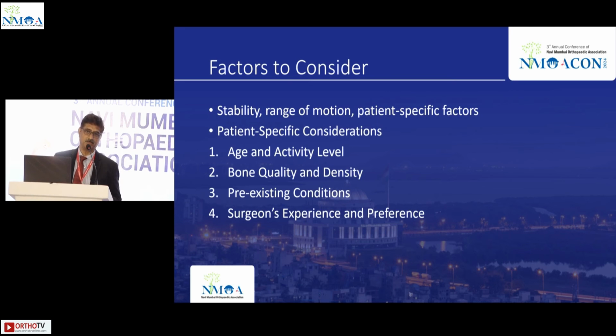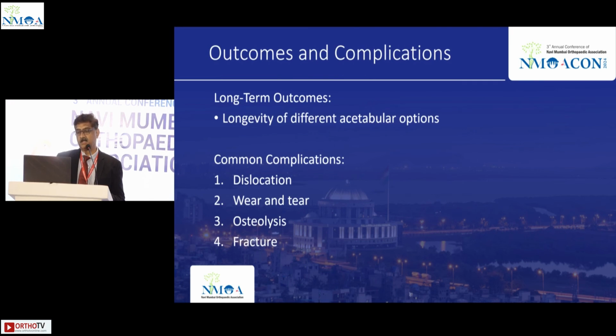Factors to consider while selecting the cup: stability, range of motion, and patient-specific factors. Patient-specific considerations include age and activity level, bone quality and density, and pre-existing conditions. The surgeon's experience, what the surgeon is trained upon, really matters, and his preferences matter. Outcomes and complications: long-term outcomes, longevity of different acetabular options. Common complications are dislocation, wear and tear, osteolysis, and fractures.